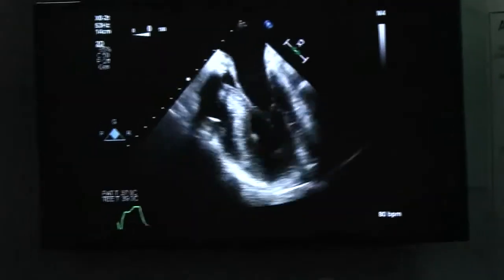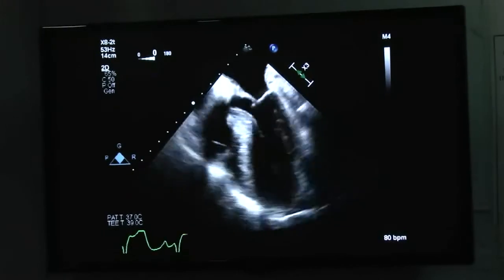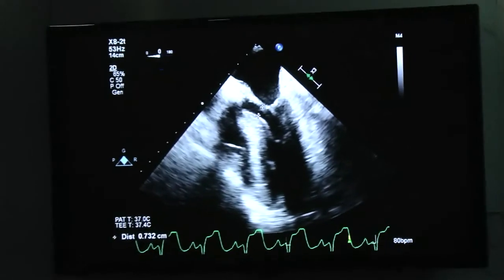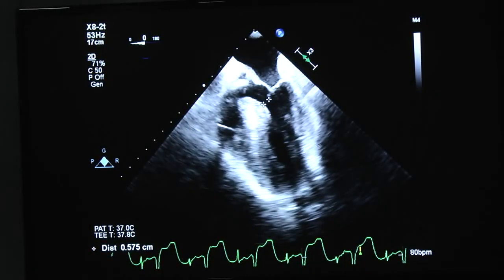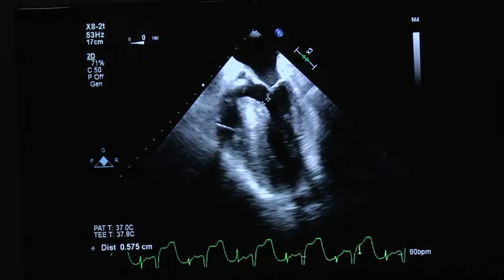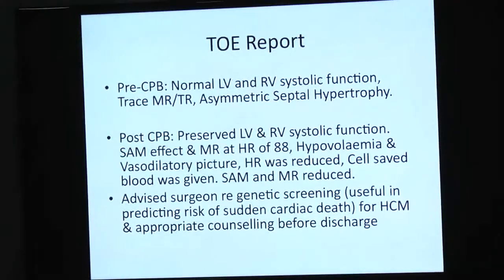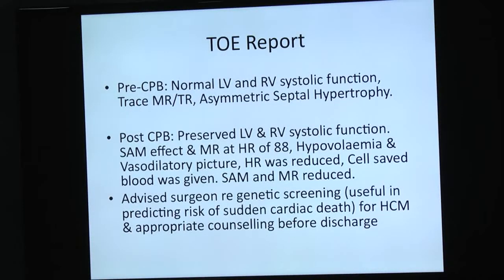Back to the case — there was a posteriorly directed jet in the post-bypass period. Measurements showed about 0.7, then 0.5 where the tip came closer to the septum with quite a bit of turbulence. What happened after this: the heart rate was reduced, a lot of volume and blood was pushed in, and inotropy was started — everything corrected and came back to normal.